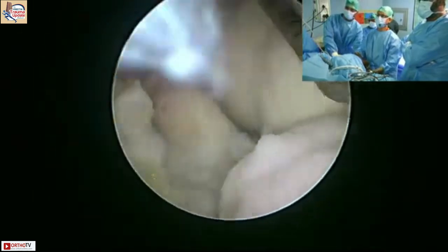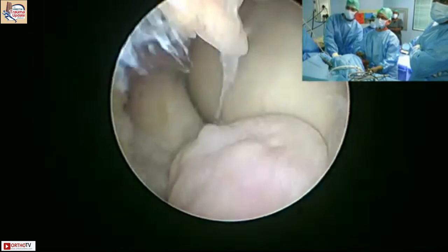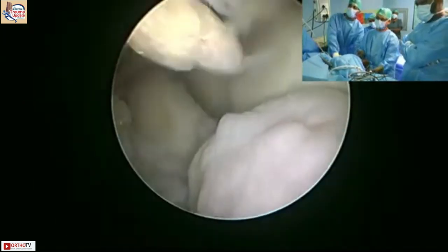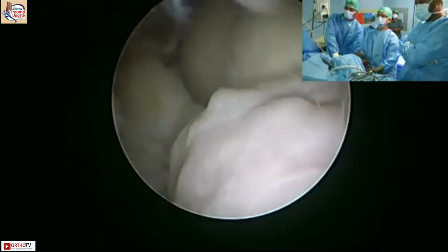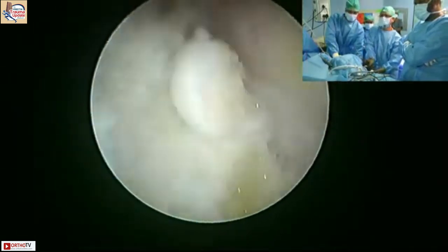That is the capitellum. So I would probably want to take this off if you had restriction of movement. So that is like doing an arthroscopic... Okay, you can see the trochlea. And then you can shift the scope onto the other side and look on this side. But he's got flexion, and then the flexion is not a problem. So it's really, if the audience want, we can take this. Otherwise, do less damage. I have to remove that bit.